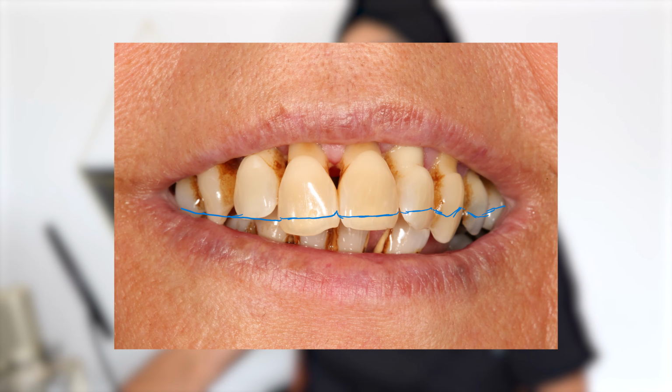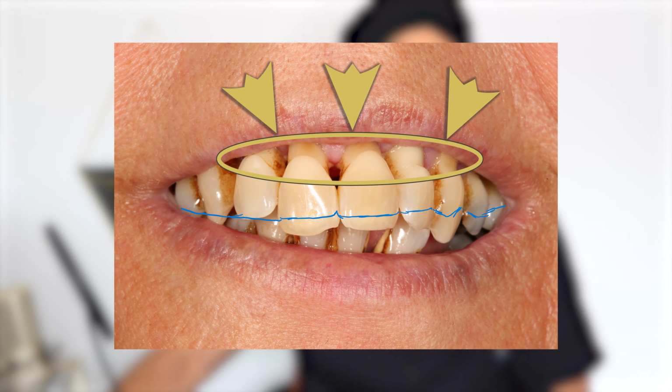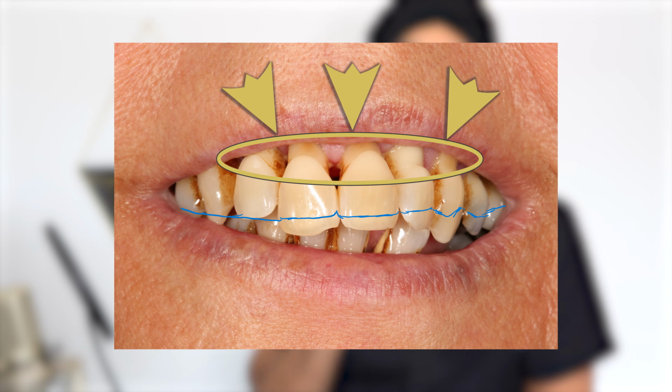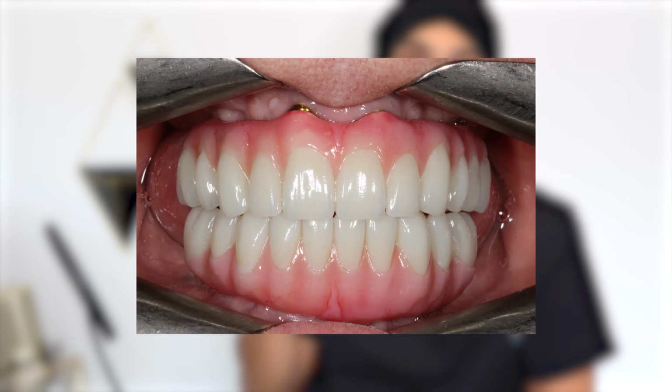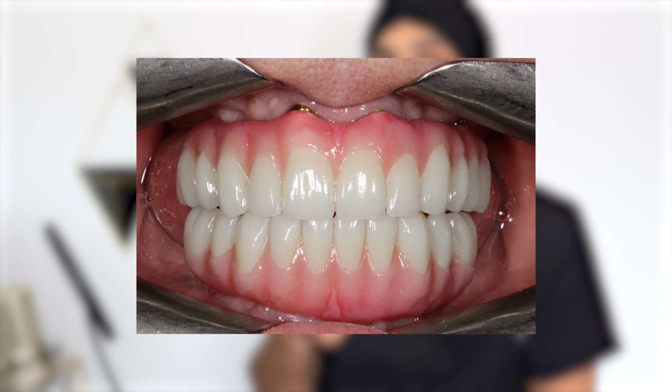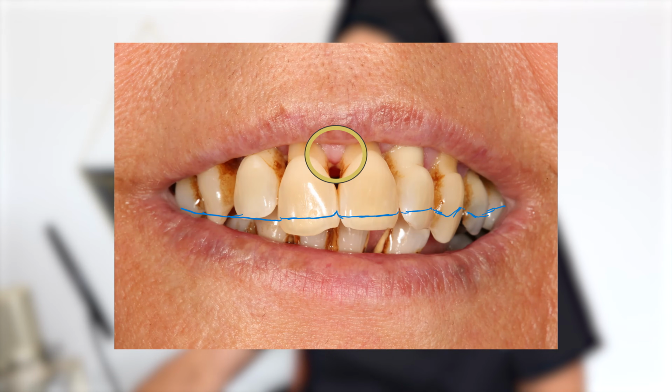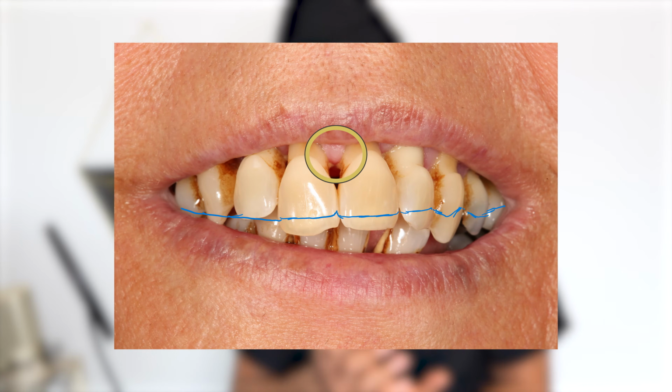We now need to think about the aesthetics of the gum, because there is something called a transition line, which I cannot hide. The transition line is where the prosthetic, i.e. the fake teeth and gums, start and where the natural gums stop. Here we've got the natural gum, but this is just the patient with her mouth open a little bit. We have to ask the patient to smile really wide, because right now, our patient hates the way they look. By the end of it, they'll really like the way the teeth look.